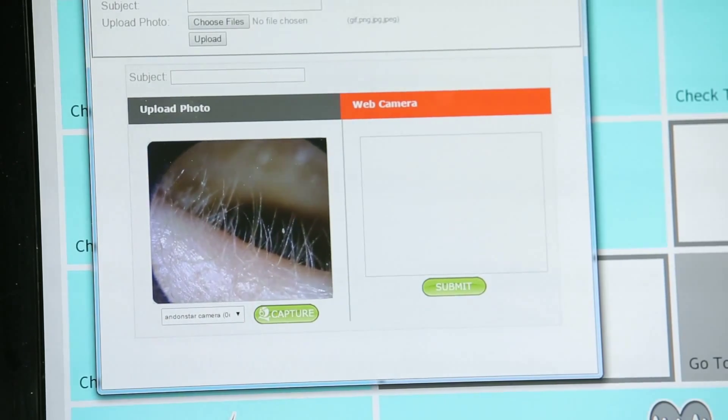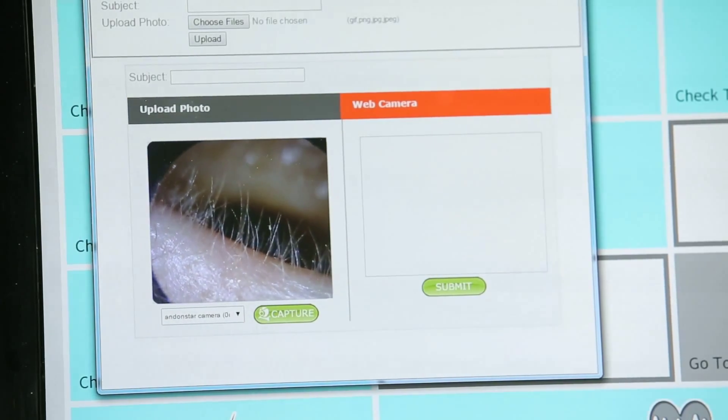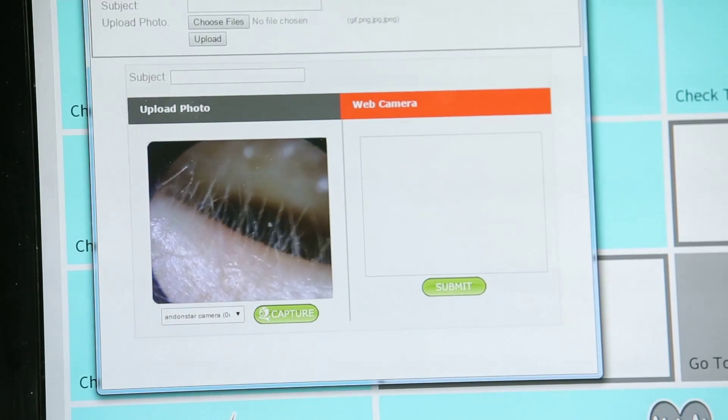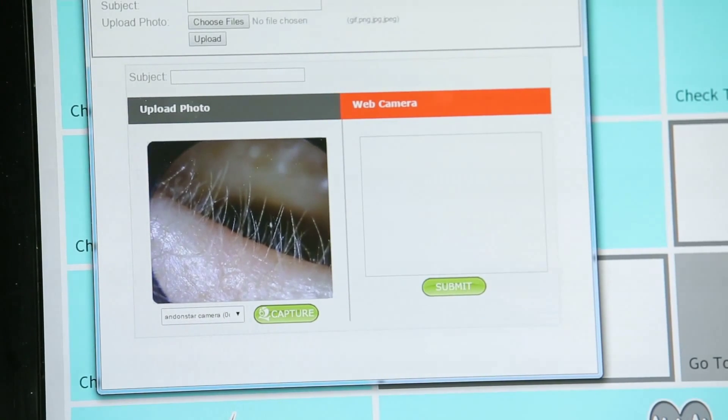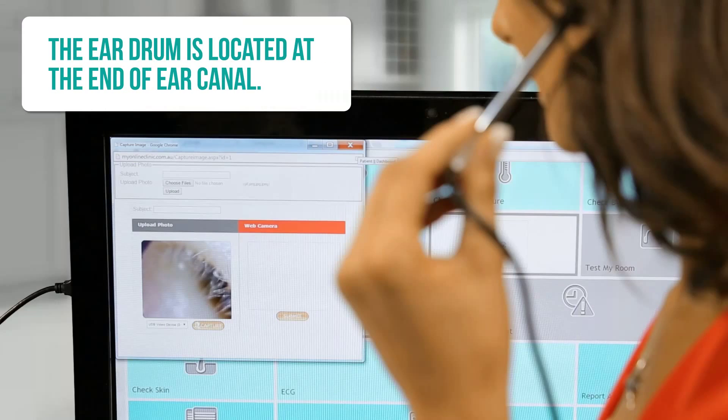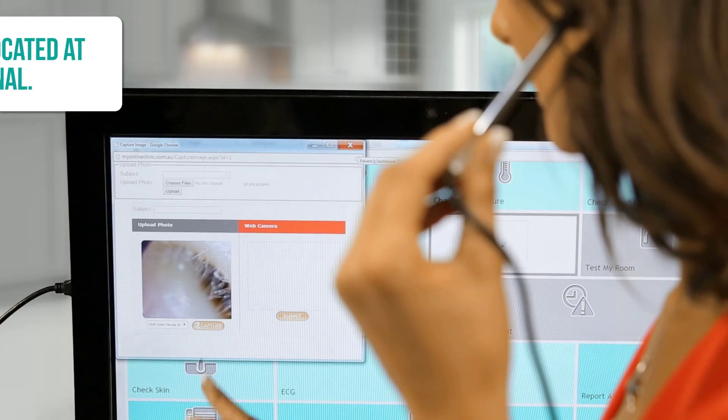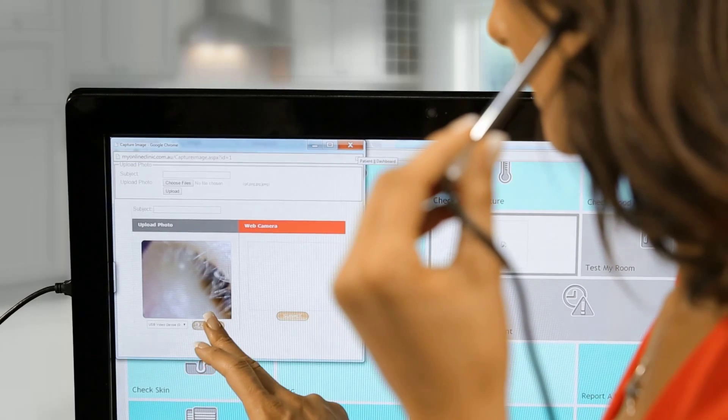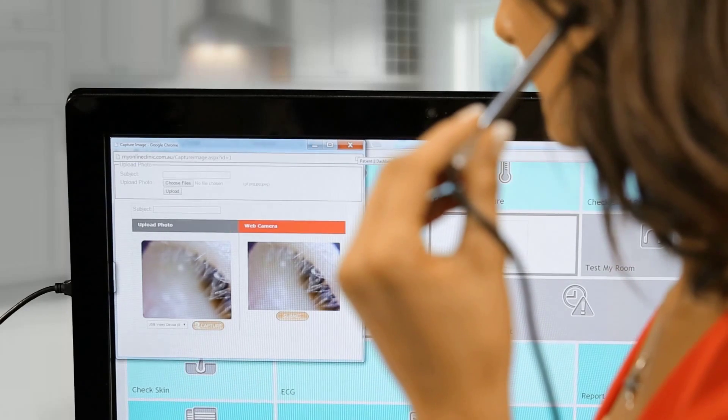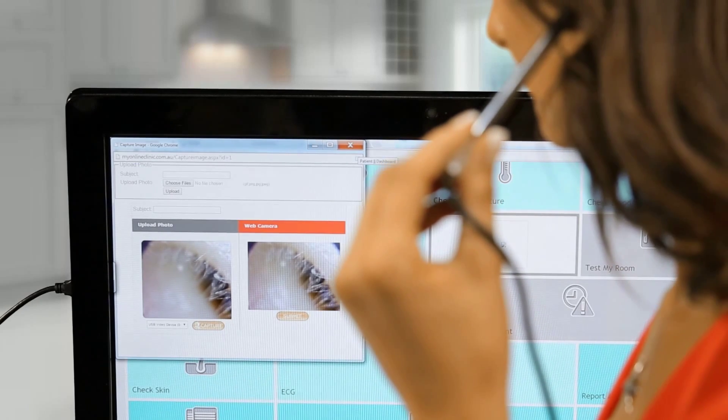Take an image of the ear canal and another image of the ear drum. The ear drum is located at the end of the ear canal. When you have the view of the image you want, click on Capture and then Submit.